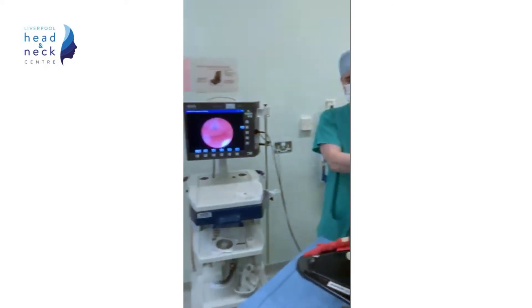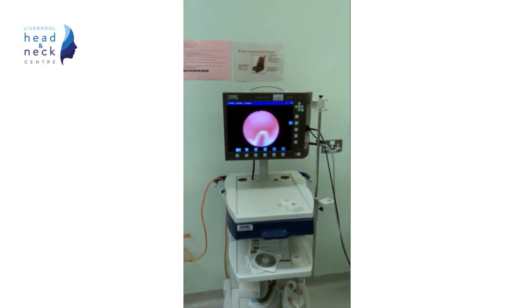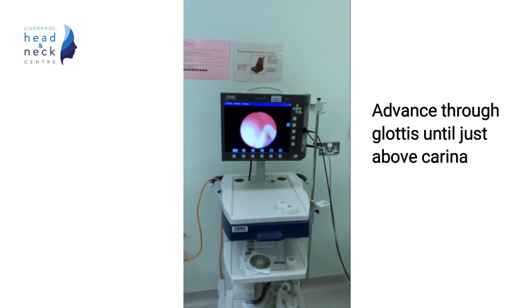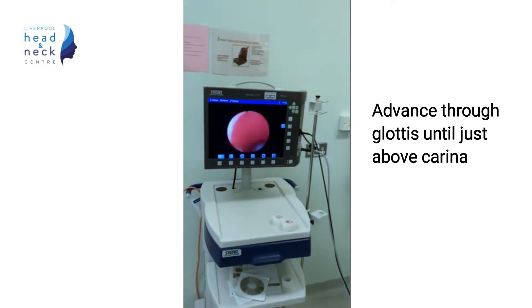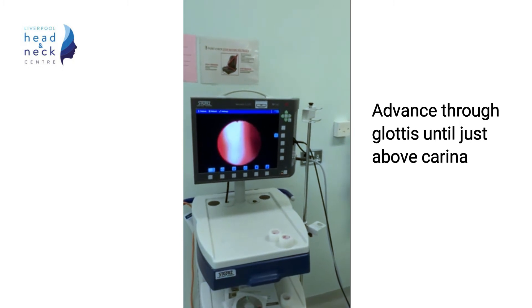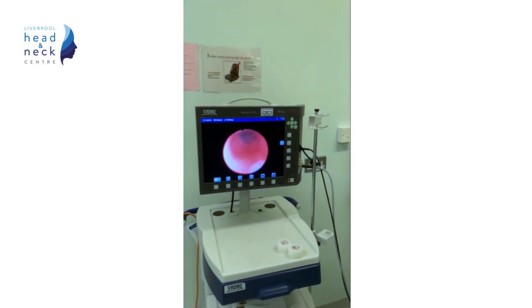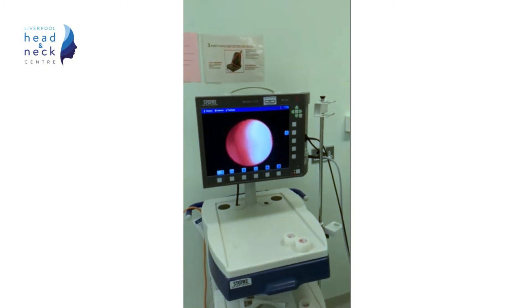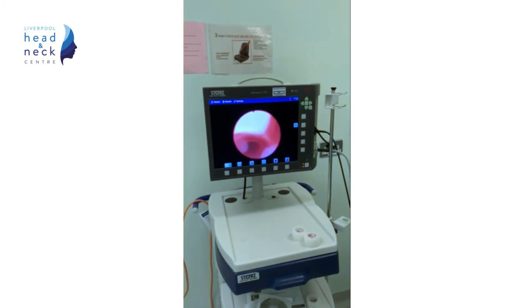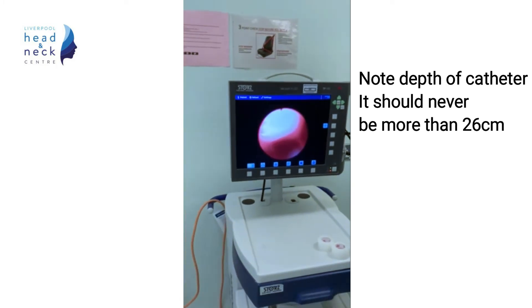The fibroscope is passed through the glottis until we can see the carina, but no further. At that point we can check the depth of the Aintree catheter. You may need to advance slightly, however never more than 26cm.